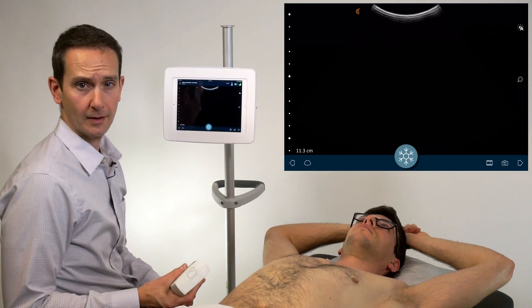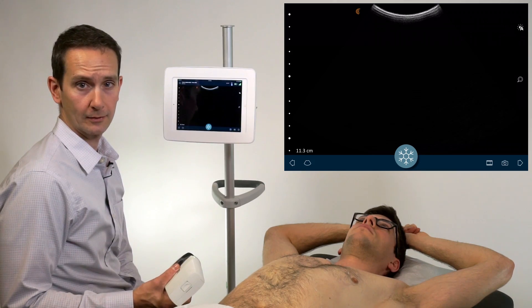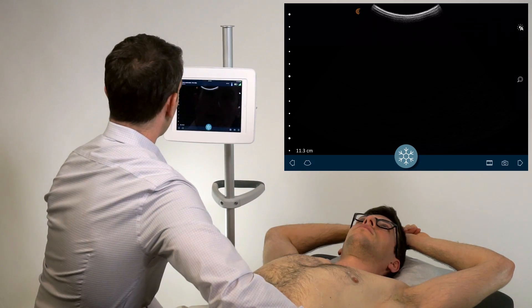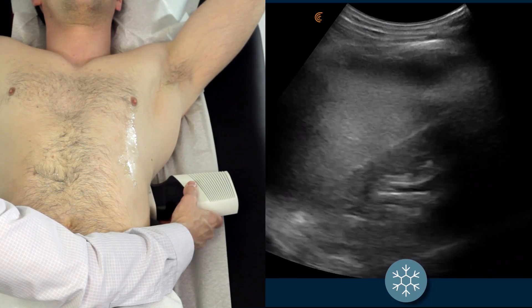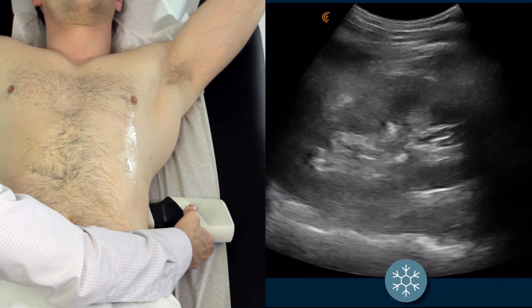The left kidney typically sits higher than the right kidney, as the spleen is not as large as the liver, so you may have to come up one or two rib spaces comparative to the right in order to find the left kidney.